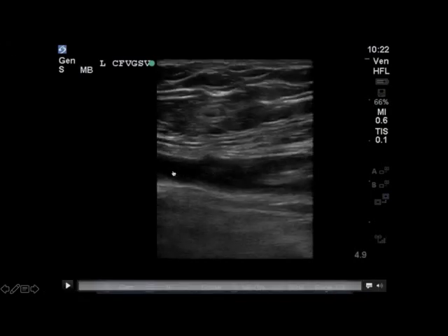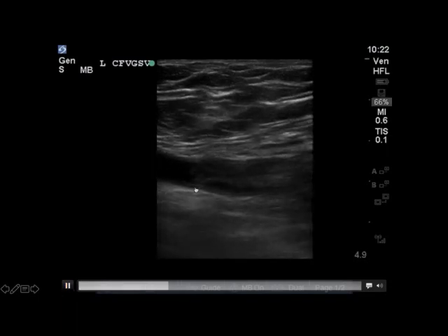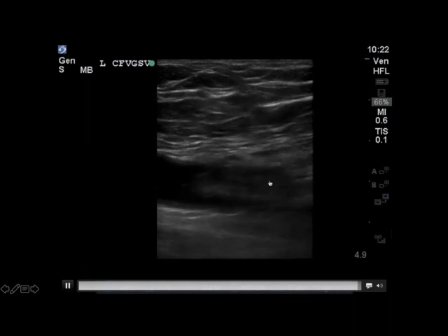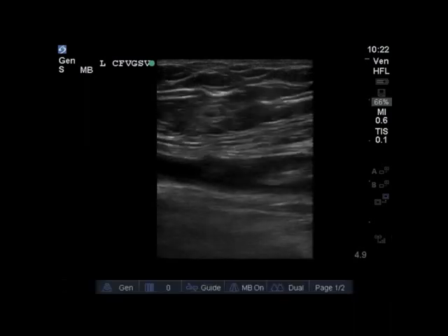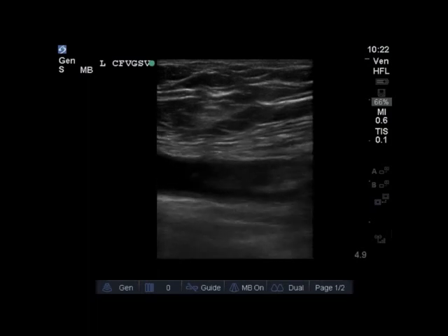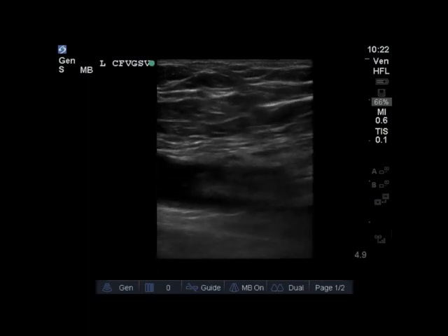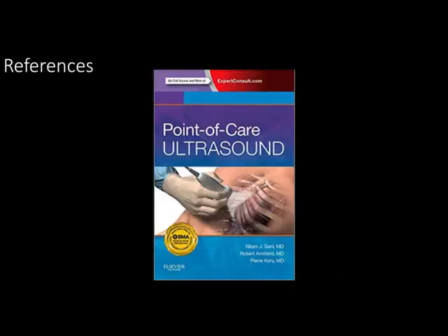Finally, looking at this in a long-axis view with the transducer dot towards the patient's head, as you move distally within the lumen of the vessel you're able to see echogenic material in keeping with deep venous thrombosis. On attempted compression, we're really not able to compress the vessel very much as a result of the clot present in this patient's common femoral vein, confirming this positive deep venous thrombosis exam.